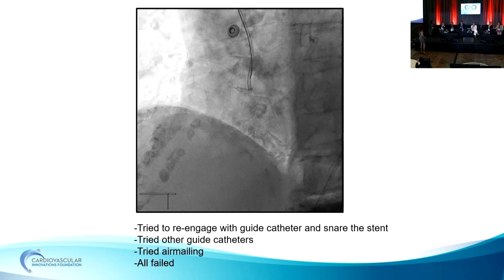It looks really radiopaque. It's a synergy stent. That's right. Well, because it's not expanded either. Yeah, it is synergy. If it was the Biotronik, you'd probably not be able to see it well. All right. Well, I love synergy stents. I'm just saying that was the.